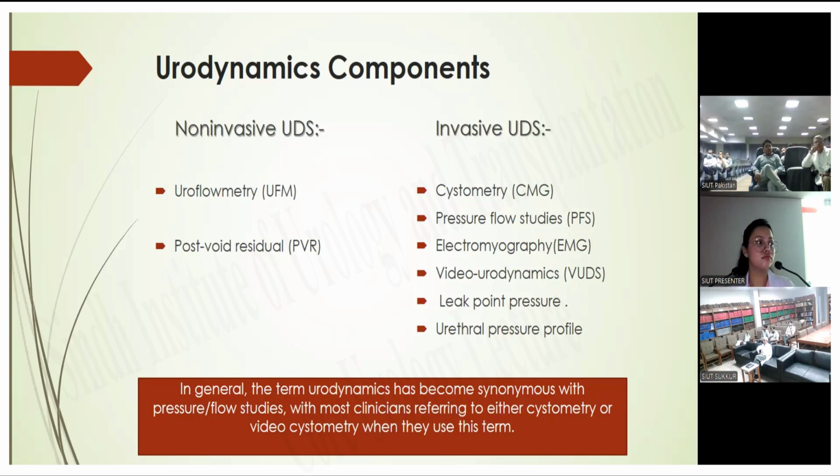Once you have taken care of patients with spinal trauma and neuropathic bladder syndromes, then the realization of neurophysiology and the neurourology clinic would come up. When that maturity is reached, you would need electromyography and urethral pressure profile and things like that. So I think now is the time, because once you go up to that level, you need to know where your spine is actually overacting, in a way that the whole bladder and urethral unit is overwhelmed by something else, then you must do something called posterior rhizotomy. But before doing all these things, you must know where to gauge your procedure. The gauge of the procedure is these things.